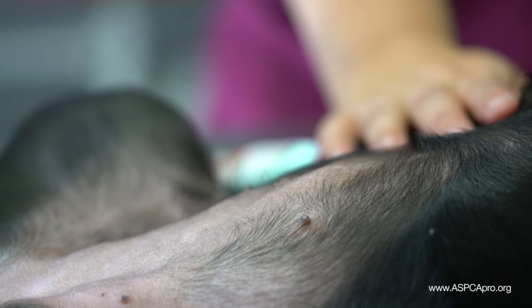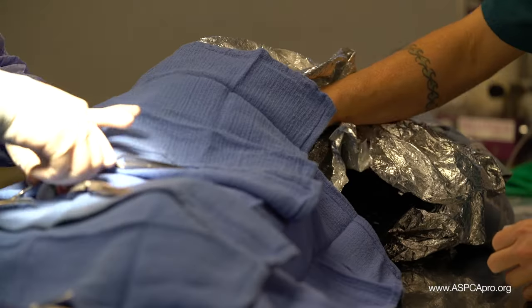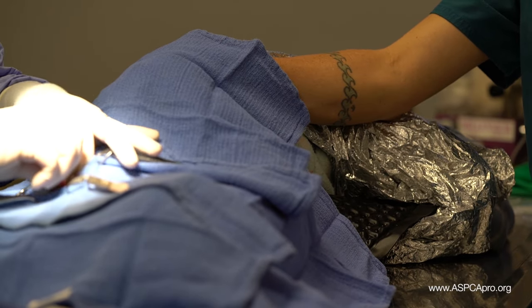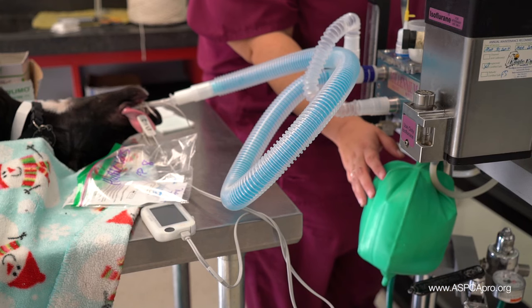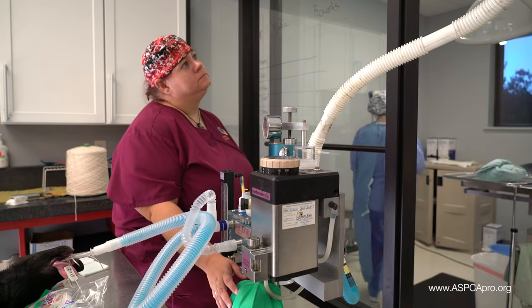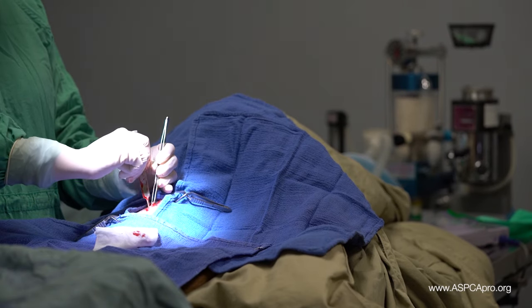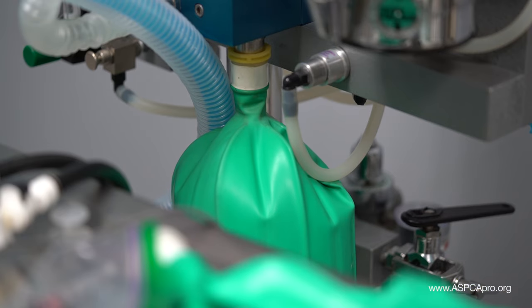To monitor respiration rate, watch the patient's chest rise and fall. If surgical drapes are obscuring the view, it may be necessary to reach under the drapes to feel the chest expanding. The reservoir bag on the anesthesia machine can also be watched, as the bag will deflate as the animal inhales and inflate as the animal exhales. Pay attention, however, as a surgeon's movements may give the false impression of breaths.